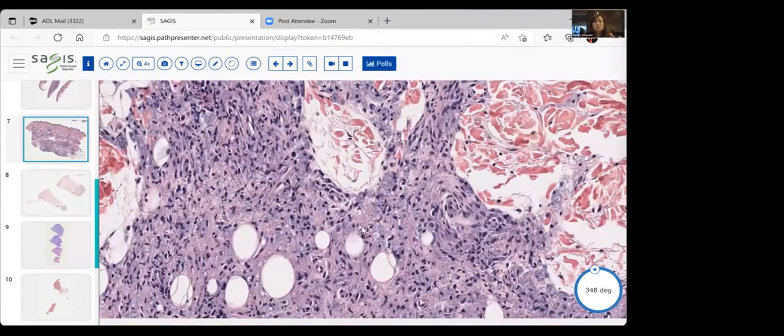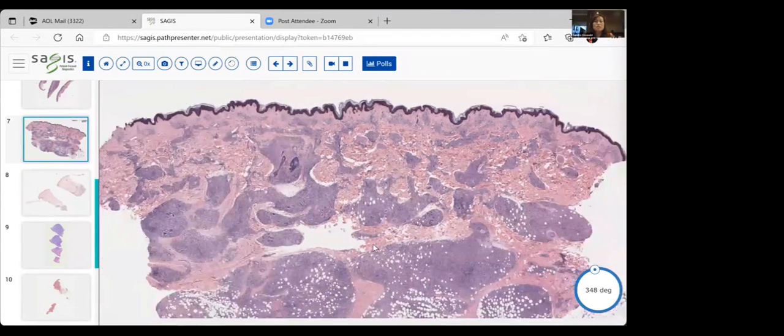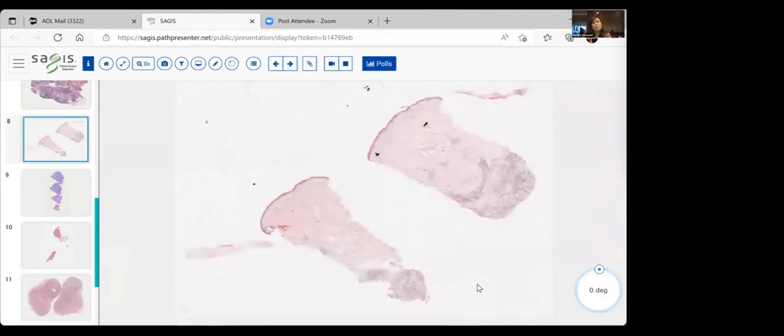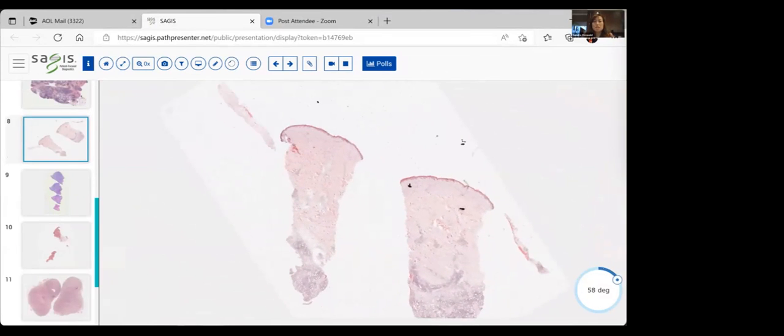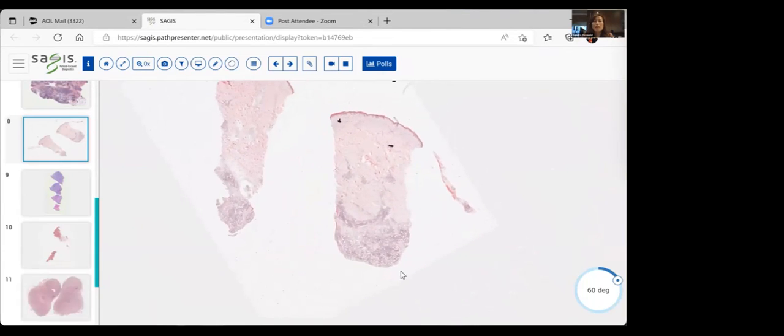I'm going to come out again so you can see the faraway picture of these granulomata in Hansen's disease. Now, number 8 is not a very common condition at all. This is a punch biopsy. I think they did a wonderful job getting to where the action is, because you can see in this punch biopsy that the action is occurring down deep, right here, deep in the fat. This is a lobular panniculitis of sorts, so we want to look down here where the action is.